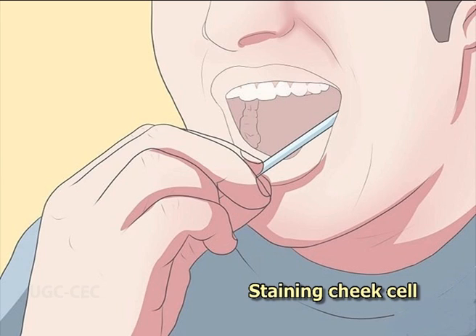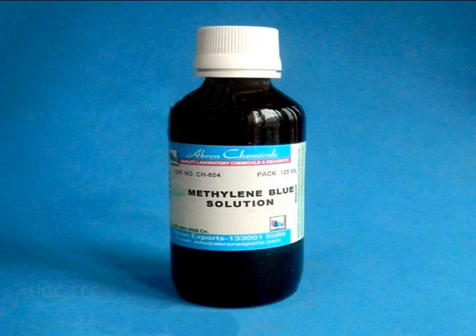Staining cheek cell. Method: gently scrape the inner side of the cheek using a sterile spatula, which will collect some cheek cells. Place the cells on a glass slide that has water on it. Mix the water and the cheek cell using a needle and spread them. Take a few drops of methylene blue solution using a dropper and add this to the mixture on the slide. After 2 to 3 minutes, remove any excess water and stain from the slide using a blotting paper.